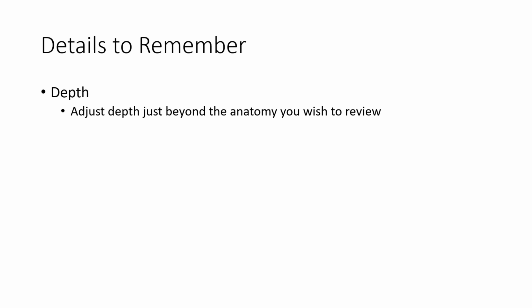So when I'm first watching somebody scan, we're always reminding our students, okay, adjust your depth, adjust your focus, increase or decrease your gain, and make sure that you have the appropriate frequency. And we're coaching them all the time to consistently make those changes until those things become habit. Things like your dynamic range, your harmonics, we use those slightly less frequently, but they can be very, very helpful in the right circumstances and save you a lot of grief when you're having difficulty seeing things. So with that, that's really the majority of our B-mode details that I wanted to review.